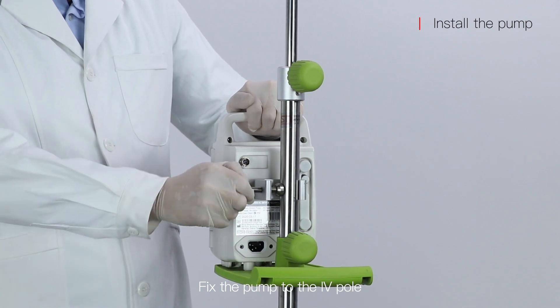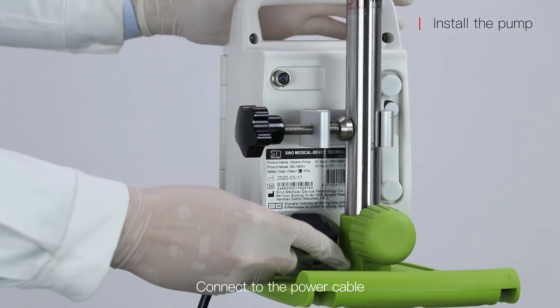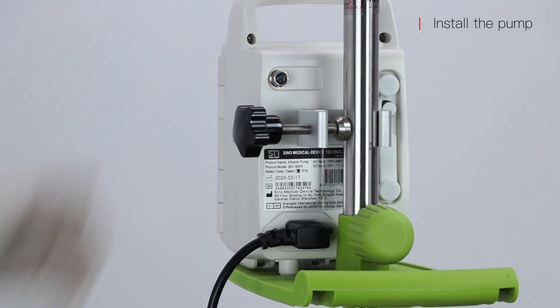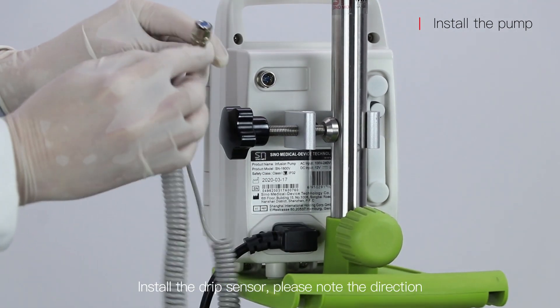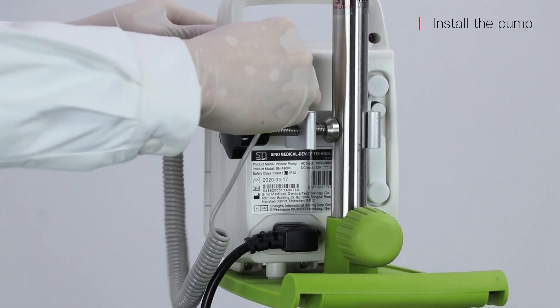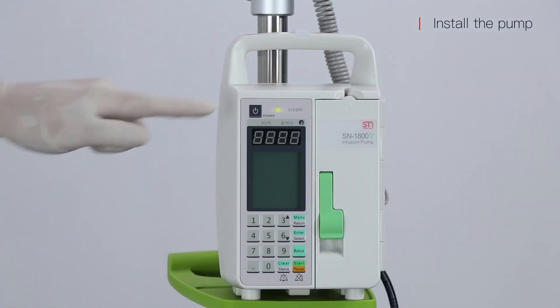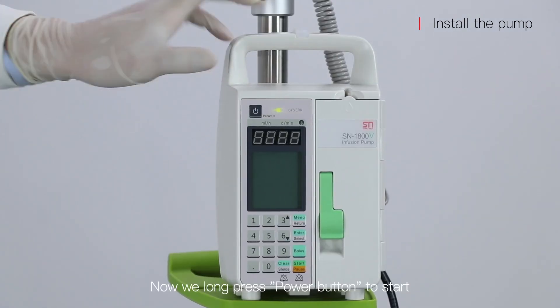Fix the pump to the IV pole. Connect the power cable. Install the drip sensor, please note the direction. Long press the power button to start.